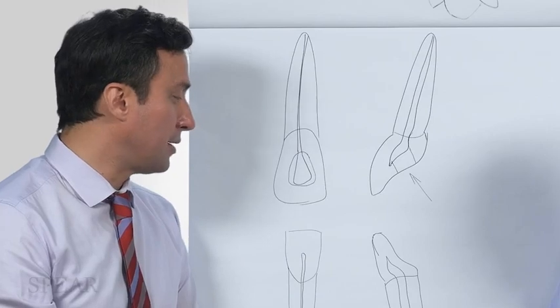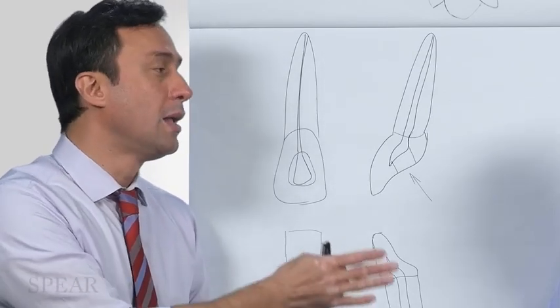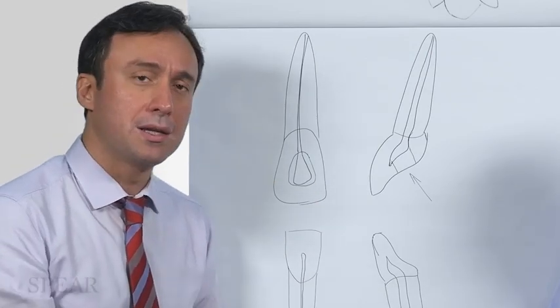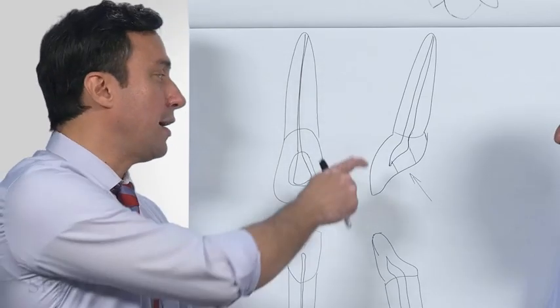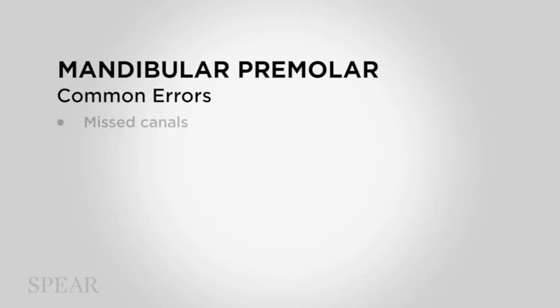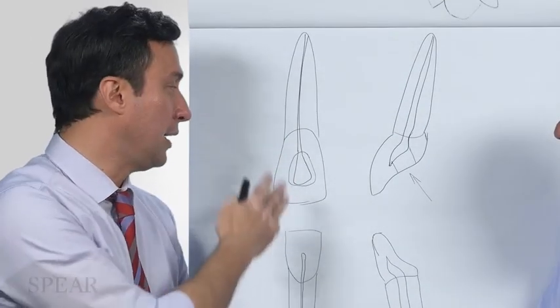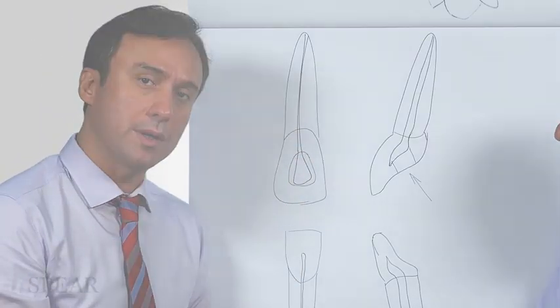Triangular oval shaped is the way to go for the maxillary anterior teeth. And it's the same way with the central and the lateral. The lateral gets a little bit more oval because it's a little bit narrower. So that's the thing. And the common error is basically getting out in a buccal direction and perforating buccally. Also, you can have mesial or distal perforations if you have poor inclination, if you're not aligning yourself properly with the long axis of the root while you're making your axis preparation.